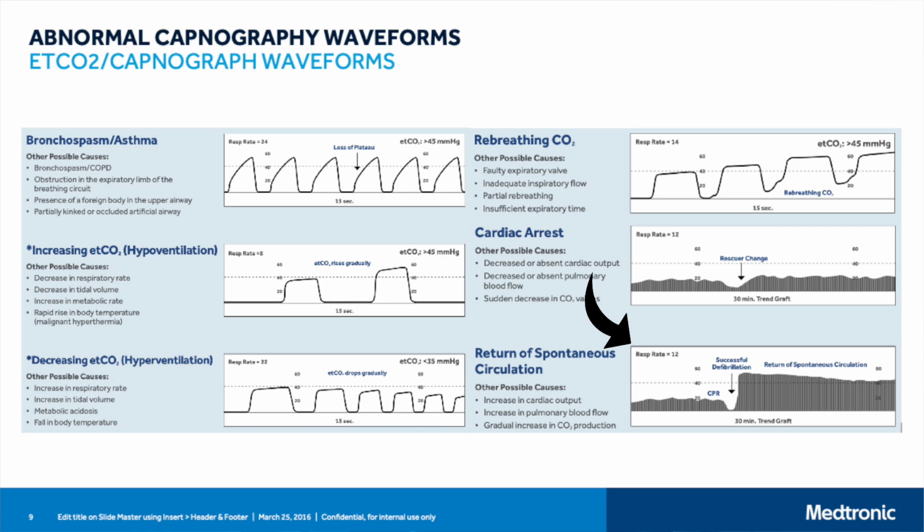Another point of capnography during CPR is ROSC. The moment you hit ROSC, you're going to see a drastic rise in that waveform because of the ventilation and gas exchange. You can't have ventilation with a big jump unless there's perfusion, right? So I always let people know, if you ever see a large change in your CO2 waveform during CPR, it's probably ROSC. I would recommend checking for a pulse.